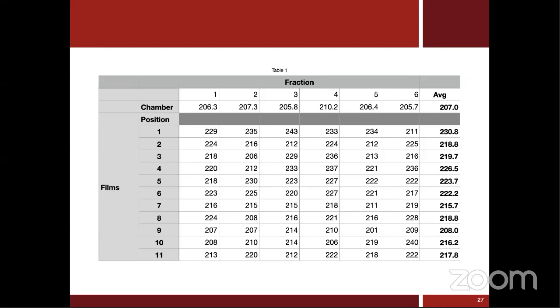For the first question, we try to touch the films with gloves. If the films are small, you can have plenty. From a single sheet, you can get around 150 small pieces of film. So if you touched one and you cannot remove the mark with a cloth or something, just don't use it. Just take another piece. That would be my advice.